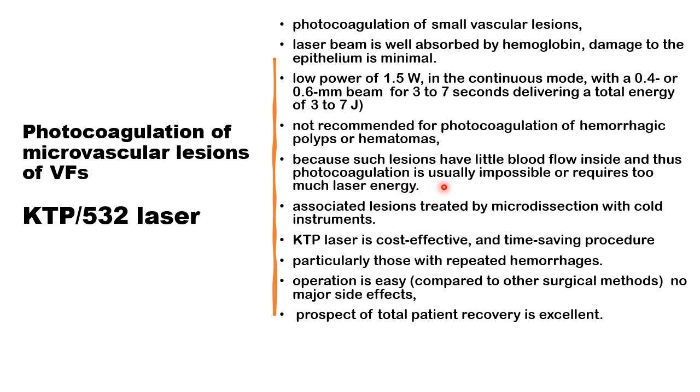These lesions, the vascular polyps or the subepithelial hematoma, are better treated by open surgical resection. But the KTP laser is cost effective and time saving and can provide excellent results compared with other modalities.